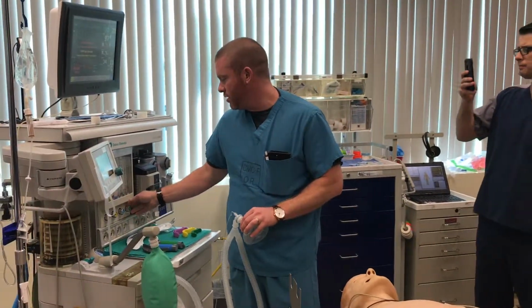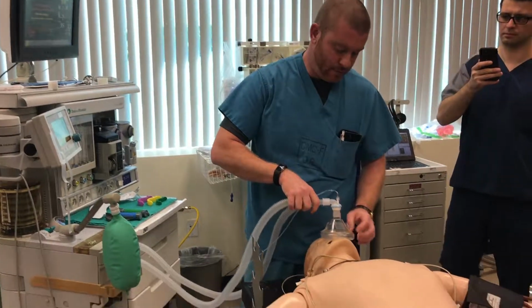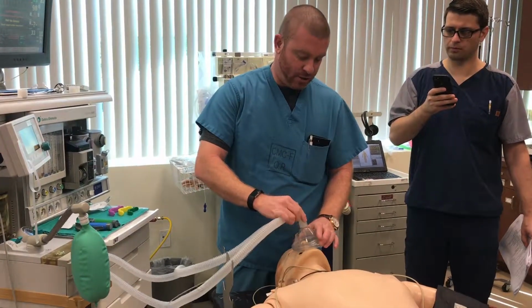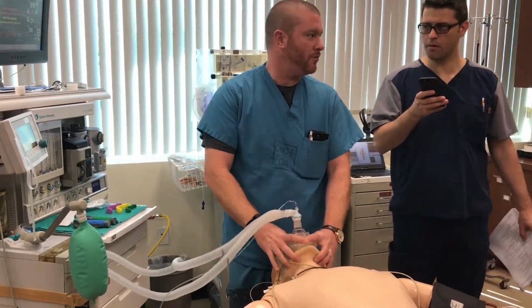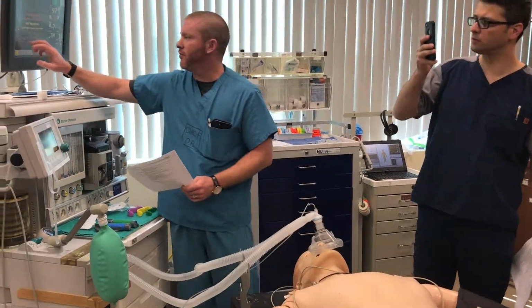First thing you're going to do, make sure you turn the oxygen on, checking your APLs off or on minimum, and putting this on your patient. Pay particular attention to make sure this is making the best seal that it can. I'm not smashing it on his face. It's an awake patient, okay? And as I do that, I come over here, I turn my alarms on.